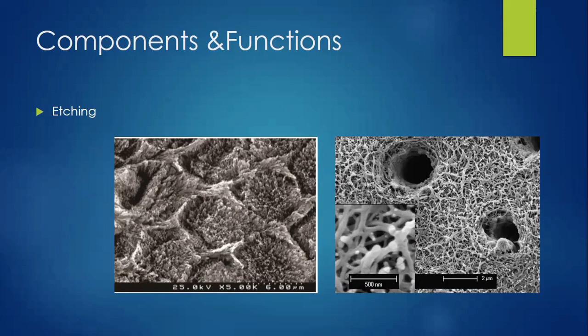So after etching, which is followed by rinsing and drying in the total etch technique, we should allow a low level of humidity at the enamel while keeping the dentin hydrated. Why do we need to keep our dentin a little hydrated? Because dehydration leads to collapse of the exposed collagen mesh, reducing or nullifying the spaces between the fibrils, preventing them from acting as a channel through which monomer may penetrate or spread. If these spaces close, they won't allow the resin to infiltrate, and we can't have a strong bonding. So this is etching.